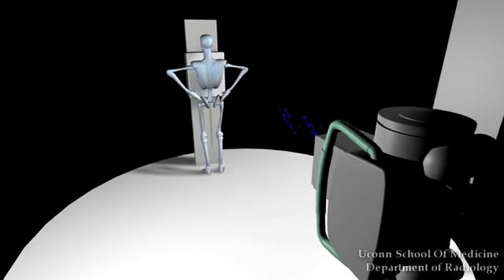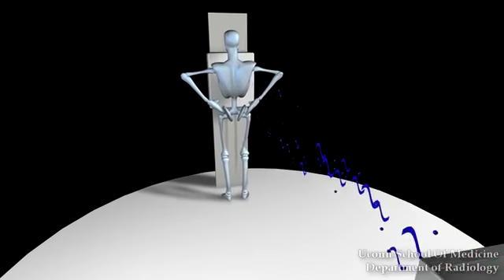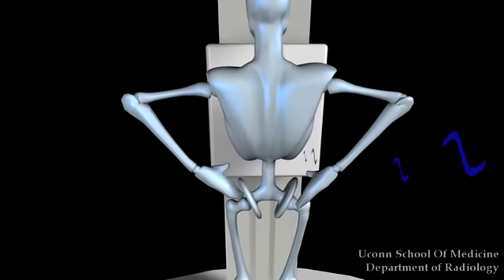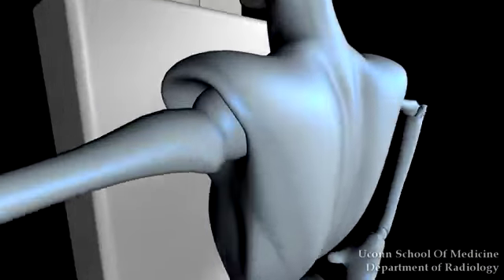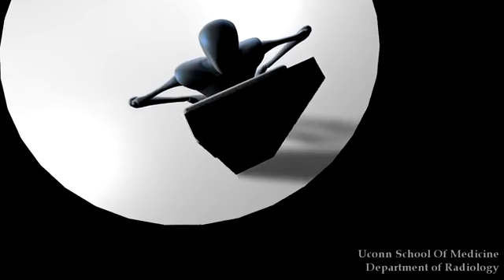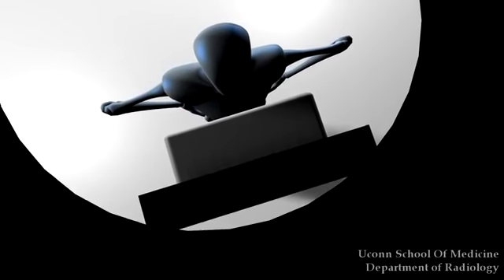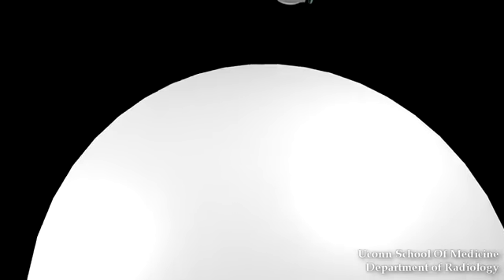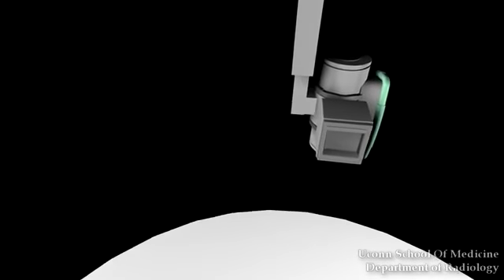The PA radiograph is obtained differently from an AP. Like its name implies, the X-ray beam passes posterior to anterior of the patient, but this is not the only difference. PA X-rays are acquired with the patient standing upright, with their hands on their hips and their elbows out to the side. This allows the heart and lungs to be optimally and accurately visualized. The PA film has other technical advantages. Since the X-ray source can be placed much further behind the patient, sharper outlines can be obtained. I will demonstrate this concept.